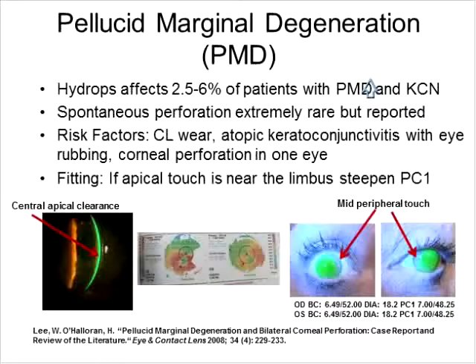I think I've only fit one patient with cross-linking. He had cross-linking and intacts in each eye, and it was essentially a straightforward scleral lens fit. So maybe someone has more experience fitting patients that have had cross-linking. Anybody?